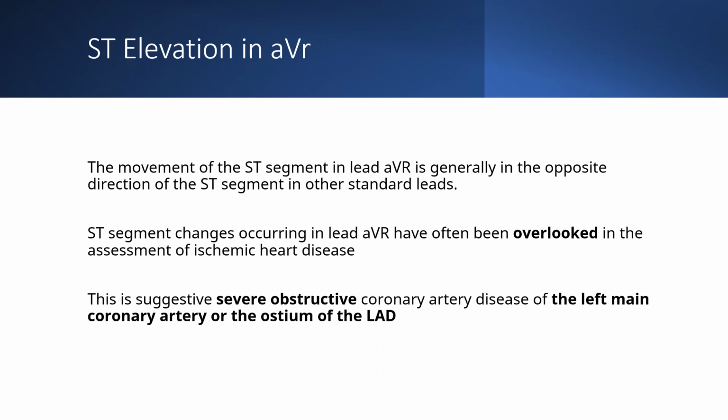Now there are some curveballs. A commonly overlooked ST segment is in aVR. Elevation in aVR is highly predictive of significant coronary artery disease. So always look at aVR, and if there's elevation or changes, alert the interpreting physician.